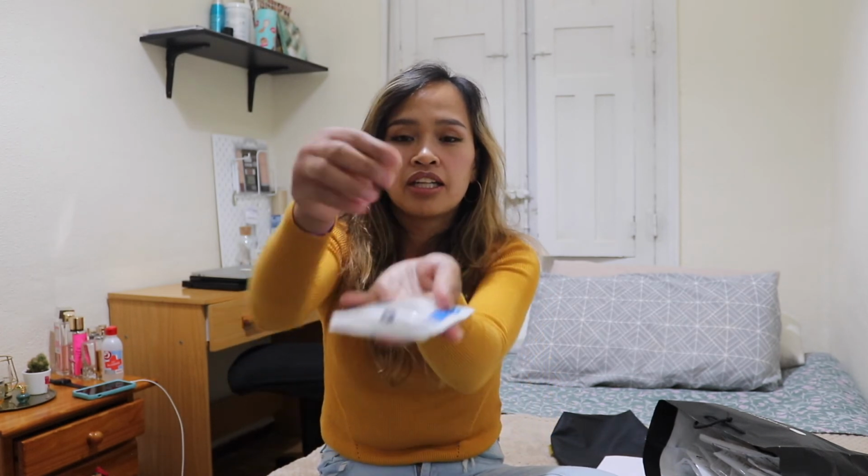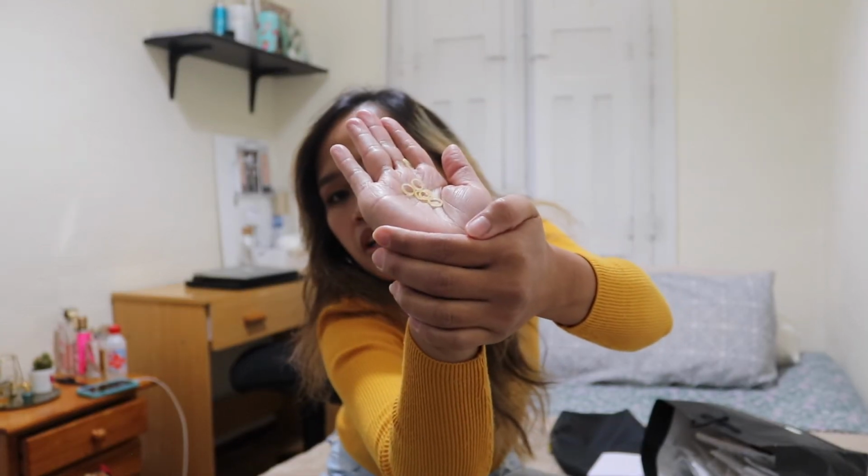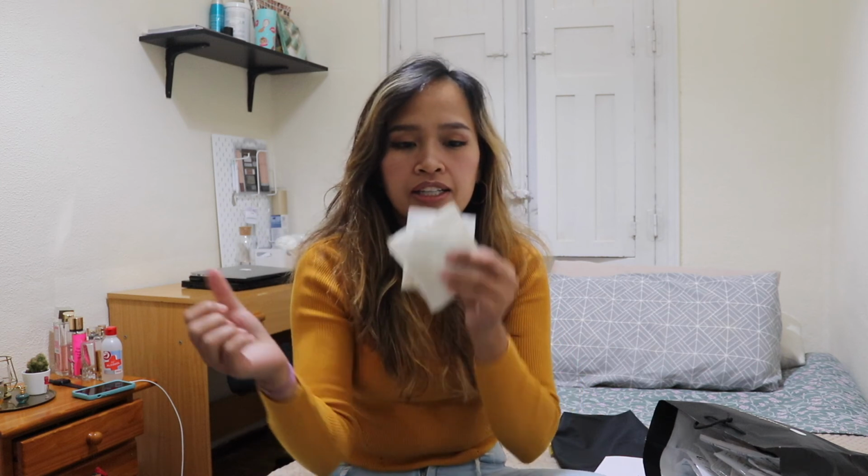In Invisalign, it also doesn't mean that it's all digital. We also have these, on the revision, because it's not perfectly aligned. These are elastics. After my revision, my dentist gave me these to make more movement and make it more aligned. I got two types, one for tighter and the other for lesser. For the whole treatment they also use this elastic, and traditional braces also use it.